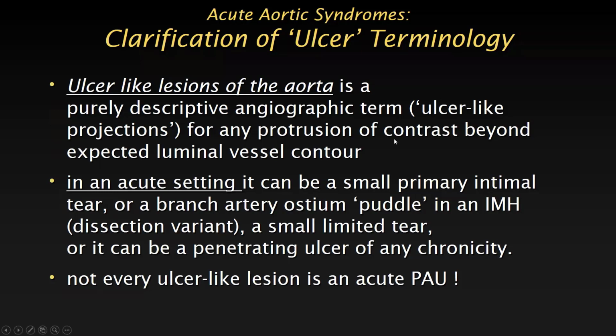People are not always very specific when they use these terms, but usually the term ulcer alone is purely descriptive, as it has been used in angio. It's actually an angiographic term that comes from aortography, from catheter angiography, where an ulcer-like lesion or ulcer-like projection referred to anything that protrudes beyond the expected luminal contour of a vessel.